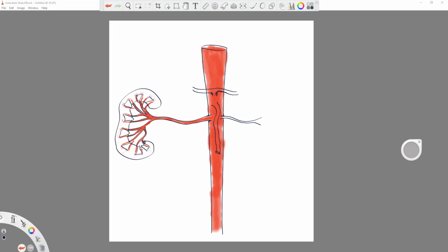So remember I said there's a two-part exam. Obviously we have an aorta. I just quickly drew in the mesenteric arteries, the celiac with its branches, and the SMA. I didn't draw in any veins on this because it's an arterial exam.